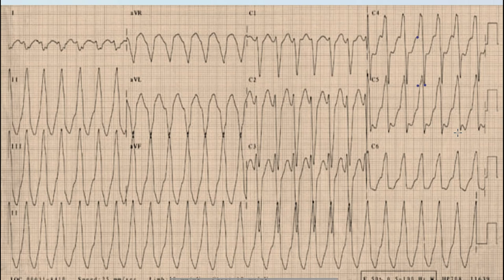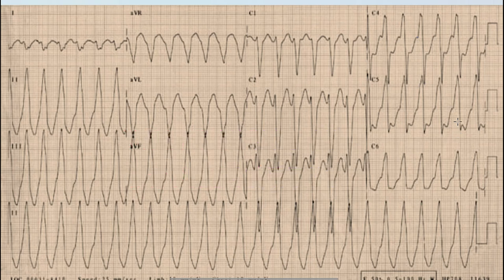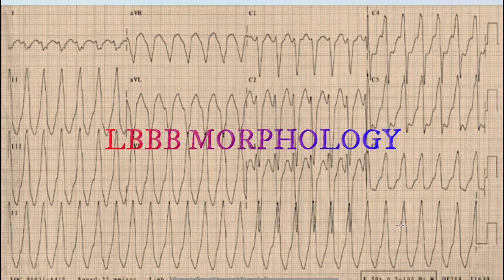So the second Brugada criterion — the distance from the beginning of the R wave to the nadir of the S wave being more than 100 milliseconds — indicates ventricular tachycardia. Additionally, the morphology of the broad QRS complex is that of left bundle branch block morphology, with a small r and deep S in V1 and a prominent monophasic R wave in lead V6, which is very typical of LBBB morphology.